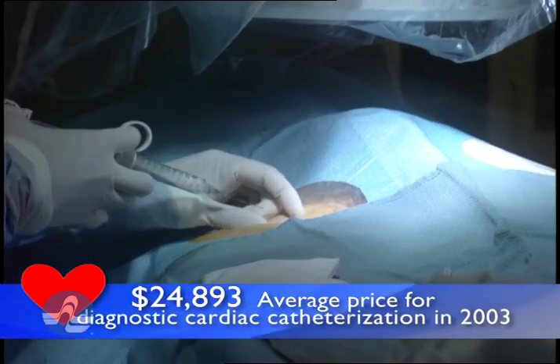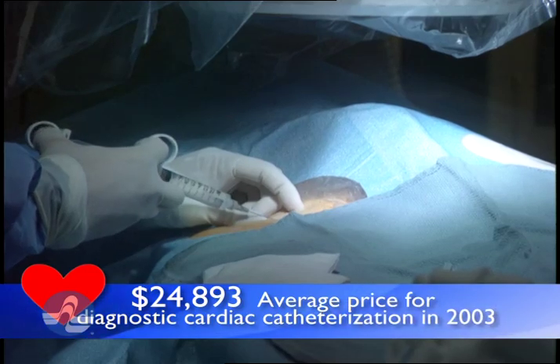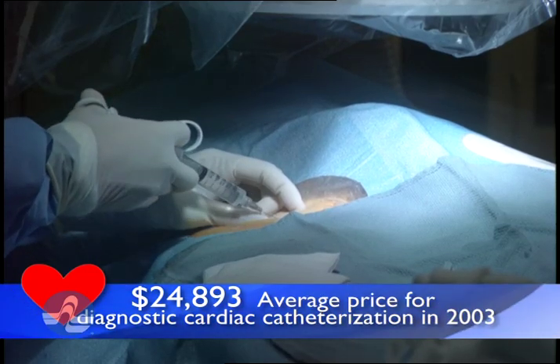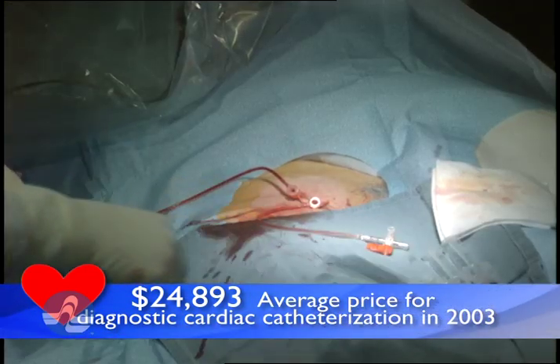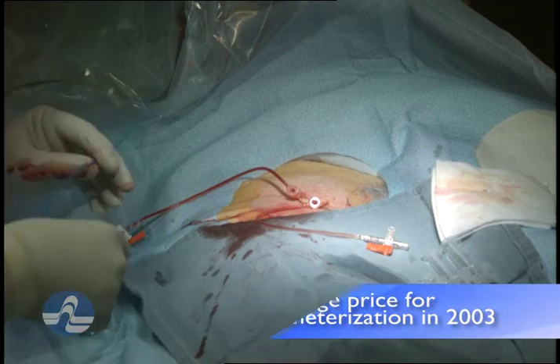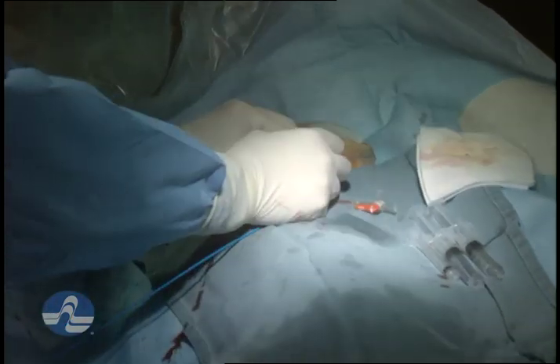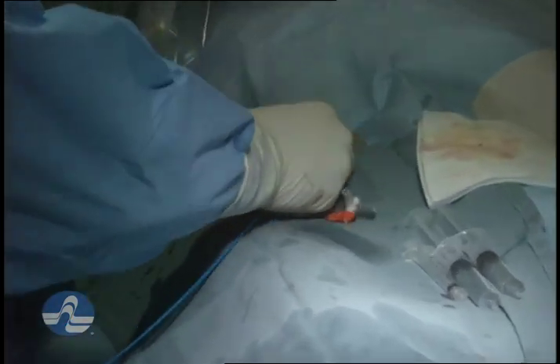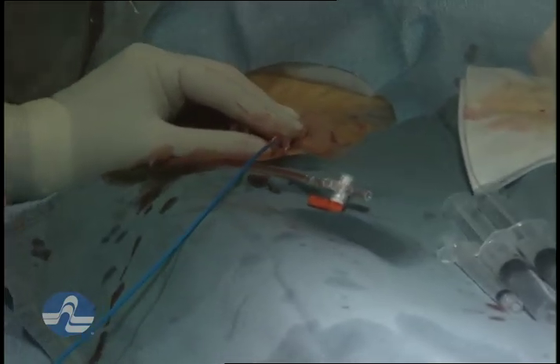Just a little bit of intravenous sedative medicine is given and a little local numbing medicine is placed in the groin. We can then take a small tube — it's only about two millimeters in diameter — and place it into an artery in the groin. The catheter is then placed directly into the artery.